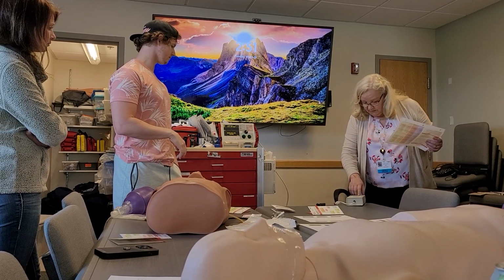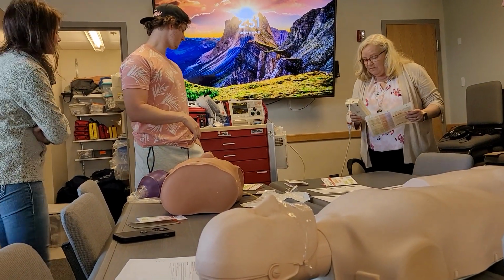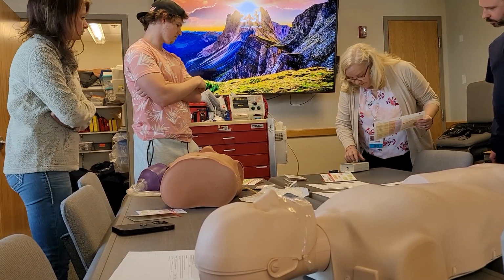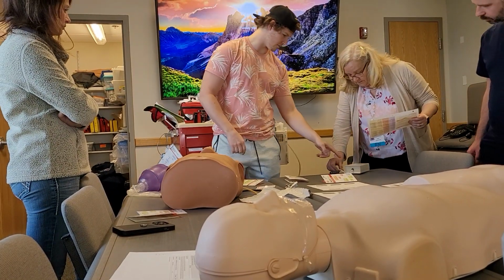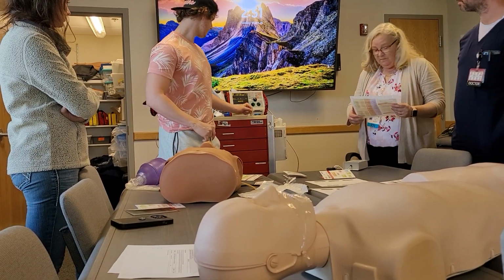You have to push the button a little harder, maybe. And it might say convert over to that. Do you have to have that on monitor? Okay. It should. Let's put it on monitor and see if it makes any difference. Or if you want, you could hook the leads up to the side. There you go. Now it's on. There we go. Okay.